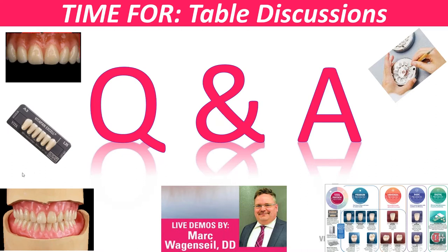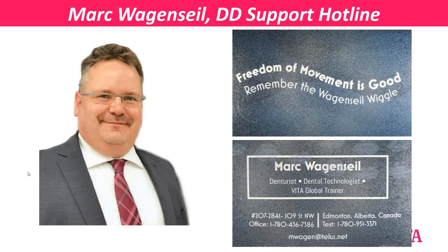The second thing is if you're using wax rims, don't make them bulky and thick. I shape wax rims in the shape of a denture with an incisal edge of a millimeter, because that's how it is in the denture. I form that wax rim just like a denture. Then I keep the top cold and warm just the occlusal surface of the bottom wax, insert that in the mouth, and have them just swallow. Then you can key it with knife marks, or make little key marks and inject some quick set material to lock it in.